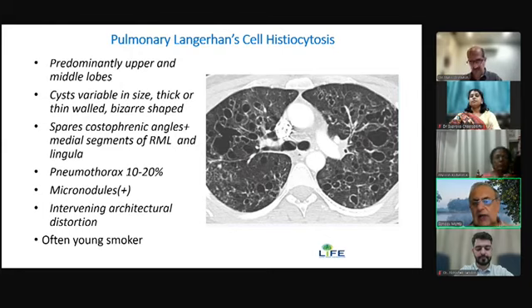But when we come specifically to the cysts, you can see that the cysts in LCH can be diffusely bizarre. Some are, you can see here, whereas in LAM they all look uniformly equal. Secondly, because it is seen in smokers, you'll see certain areas of emphysema.